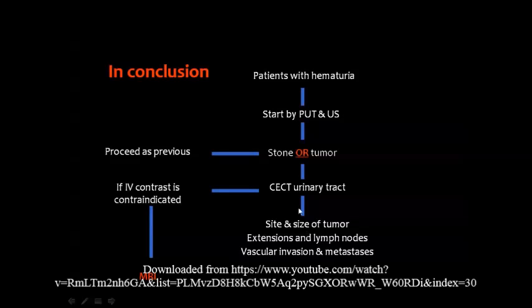But if we cannot inject contrast material because of bad renal function or hypersensitivity, then we may use MRI. And MRI, as I have said, does not require the injection of contrast material.